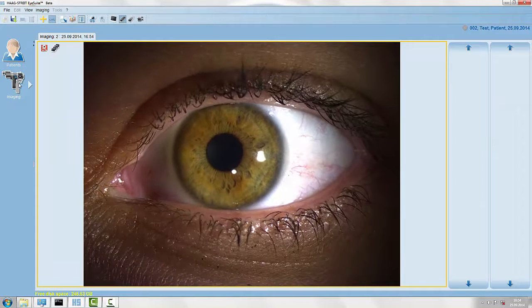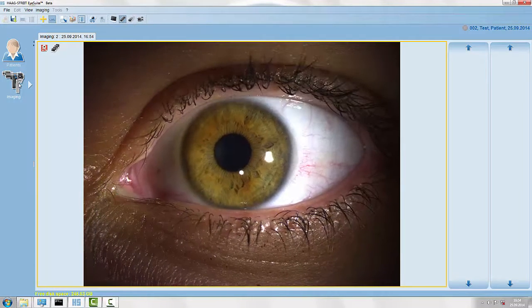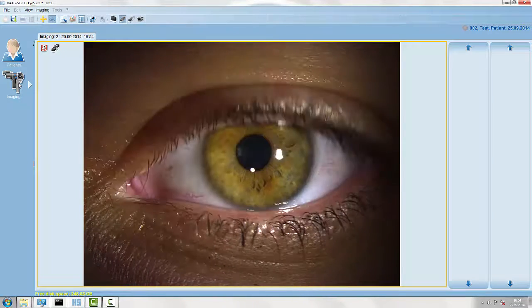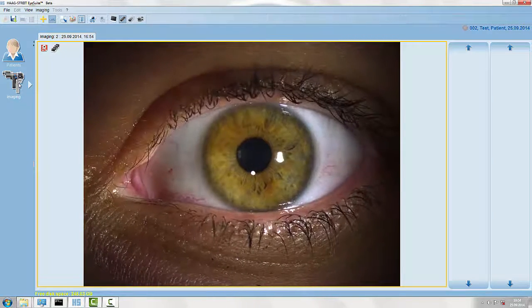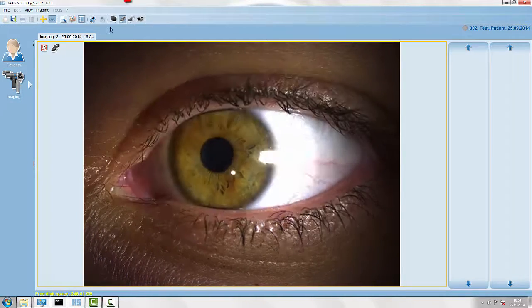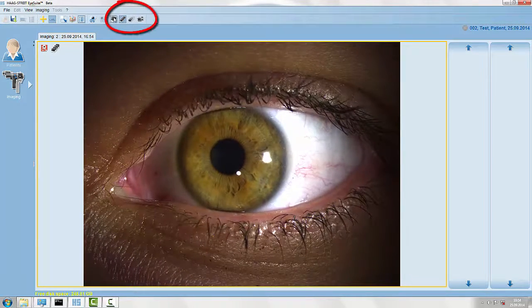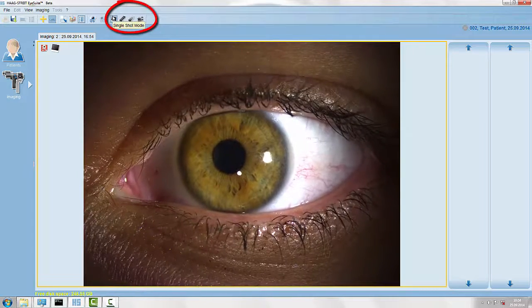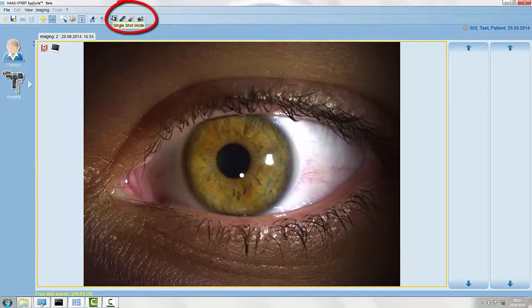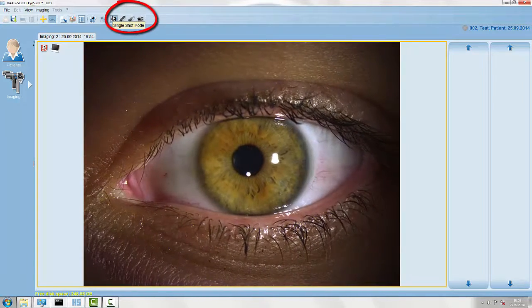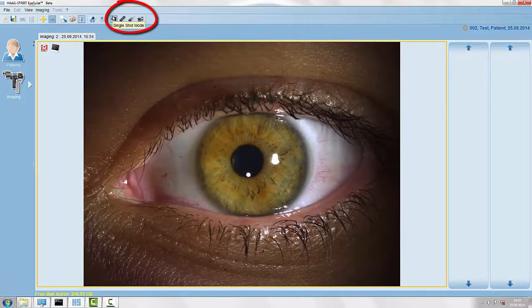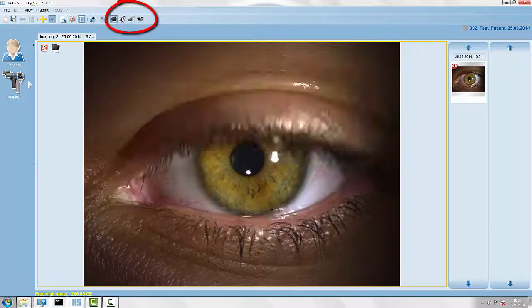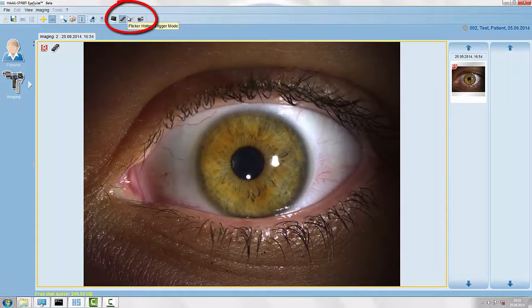An image can be captured any moment by either triggering the release module or pressing the spacebar of the keyboard. We have four different capturing modes: the basic single shot mode or the history trigger mode.